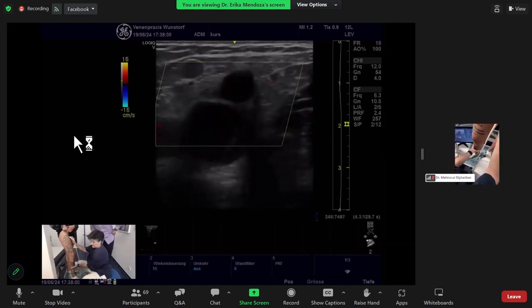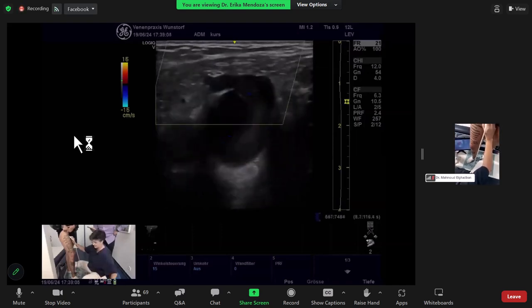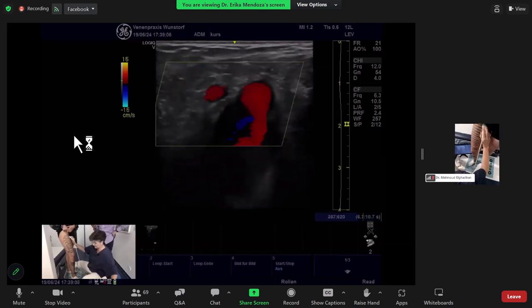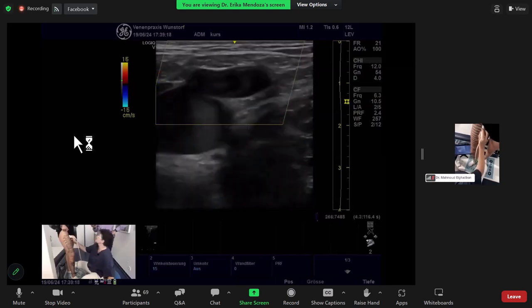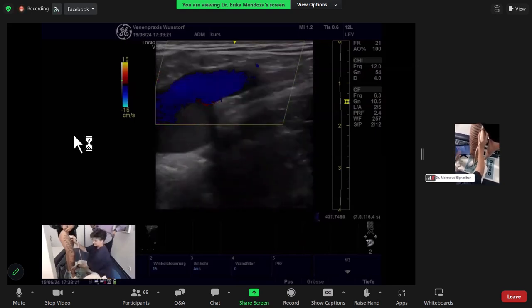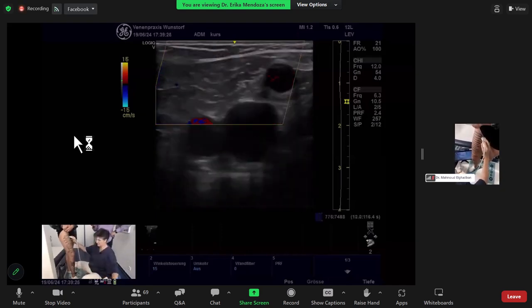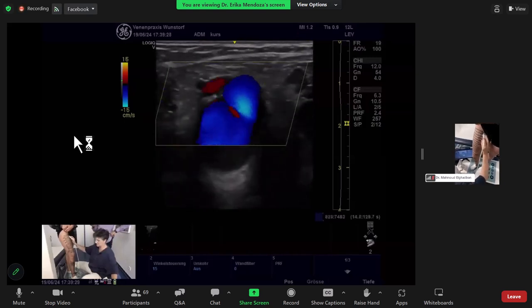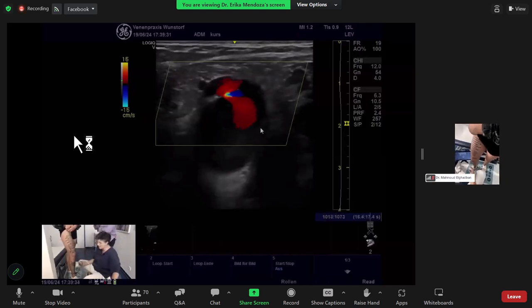And we see, it looks like a little bit comes from the deep vein. Yes, here. Sometimes it comes at the border. So I would say, perhaps it's the deep vein. I would re-investigate. You always have to look at the patient. Now, the longer she's standing, you observe here, the longer she's standing, lift the toe again and lower it, the thicker the vein gets, and now you see it would be possibly coming from the deep vein.